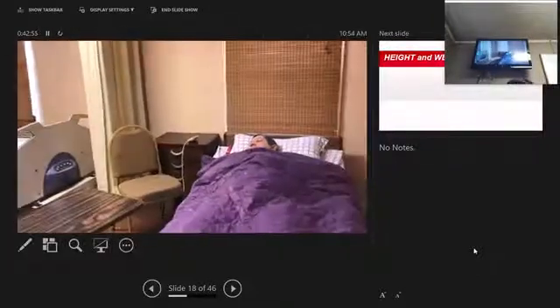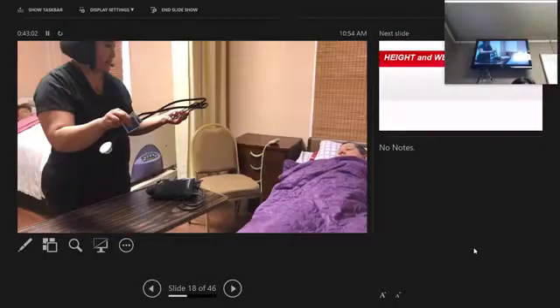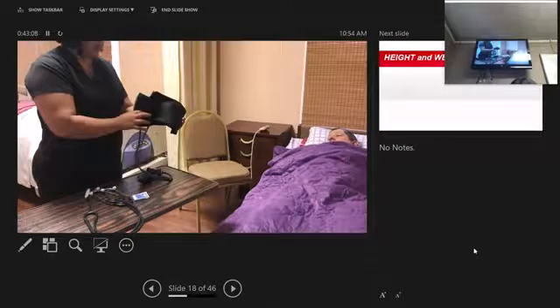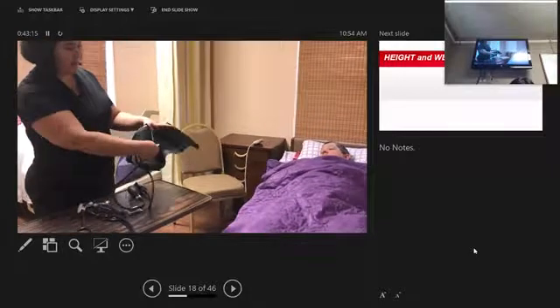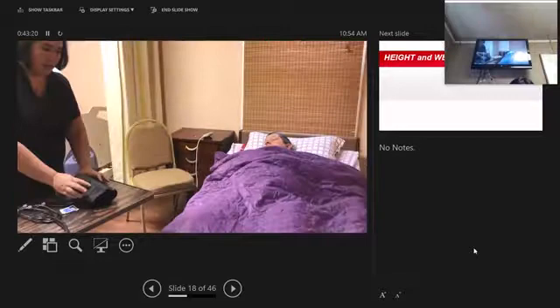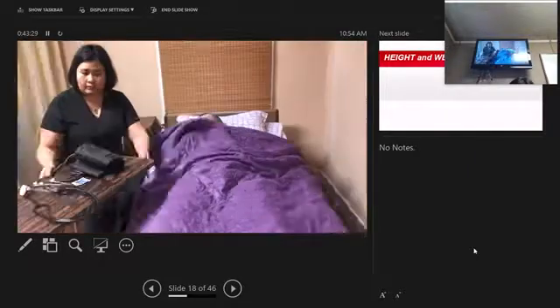Hello, Mr. My name is Tanya. I'm going to be your CNA for today. We're going to get some vital signs, and I'm going to get your blood pressure. The supplies that I'm going to need for this skill are my dual-headed stethoscope, alcohol wipes, and a blood pressure cuff that is the appropriate size for your arm, so that the bladder is within range, 10 on either side of the range here.